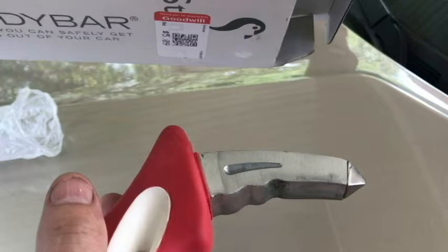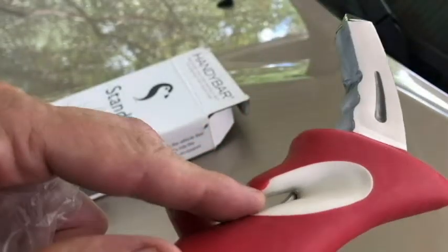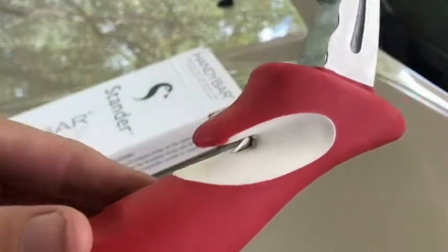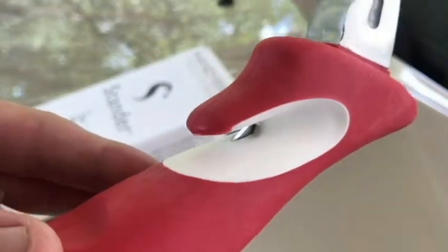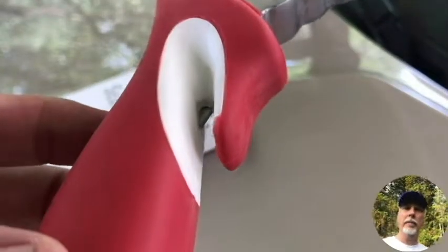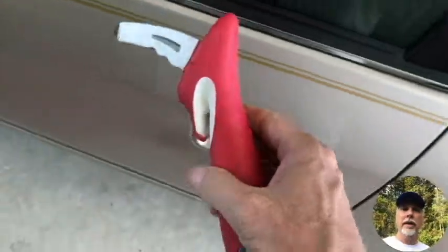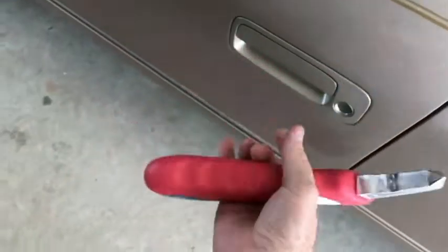What else did it say? Yes, also right in here you have a seatbelt cutter, so you have a small blade that looks kind of like a box cutter blade for that. Interesting. So let's try it out for the main purpose, and that is for assistance getting out of the door.